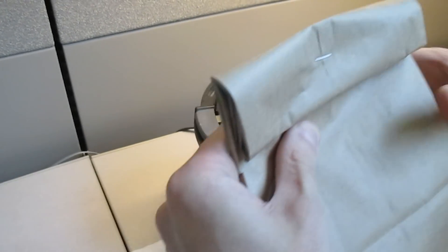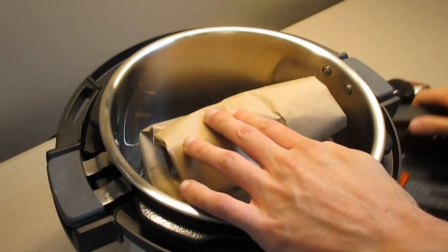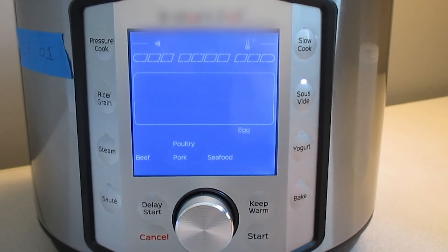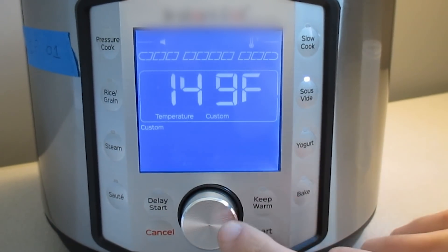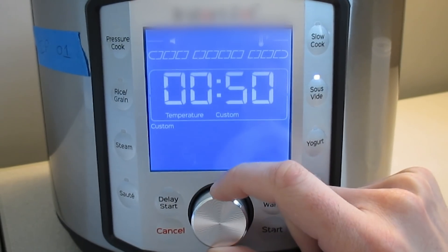Place the paper bag with the mask inside into the multi-cooker and close the lid securely. Select the sous-vide function or similar function. You'll need to set the temperature manually. When prompted, enter the temperature at 149 degrees Fahrenheit and set the time to 30 minutes.